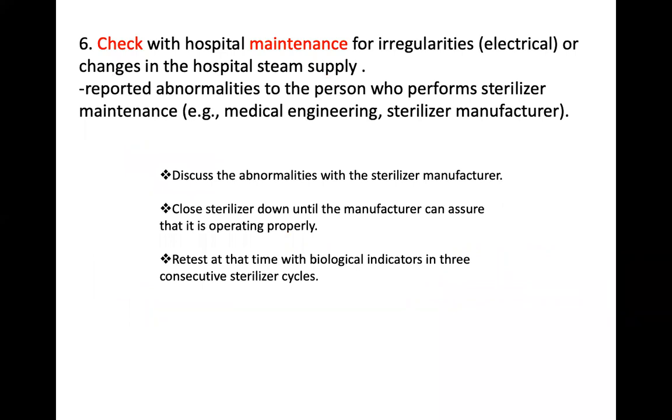If you have checked all that, and you also have checked with the hospital maintenance for any irregularities during the time that you are carrying out the cycle, for example, electrical, okay, then you need to discuss abnormalities with the sterilizer manufacturer. Go back to the source, okay? It could be an engineering fault. It could be something that requires maintenance of that machine. Maybe there's a loose bolt somewhere. So go back to the manufacturer.